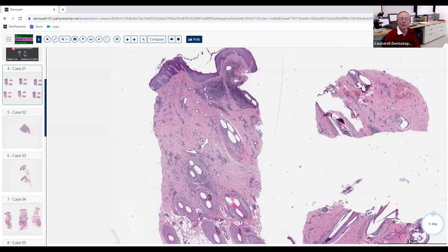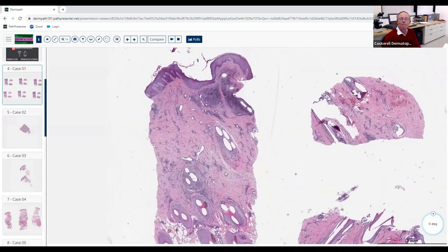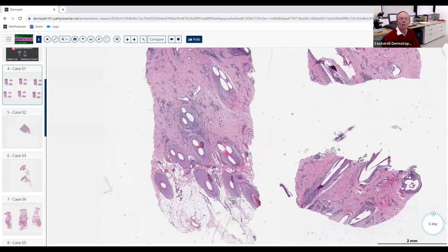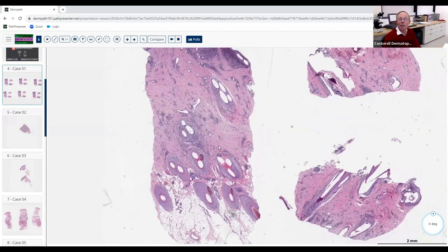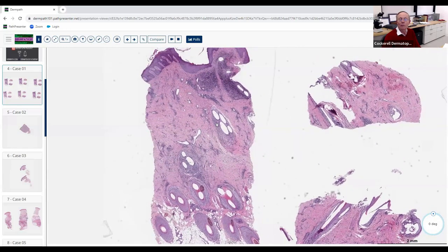If you're addicted to being right, you can always be right by just describing what you see. The second question: what part of the body do you think this is from? This seems like probably the scalp — it's hair-bearing. Notice there are a lot of hair follicles rooted down into the subcutaneous fat. If you get another hair-bearing area like the face, you don't get follicles rooted that deeply.